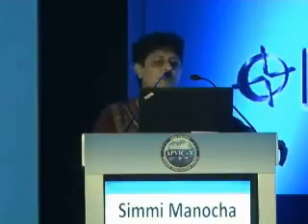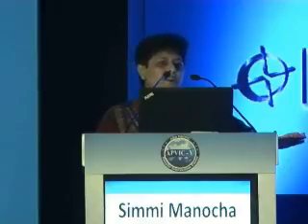So you can take a cut section, you can scan from the longitudinal view. The number one rule is that always begin with a good 2D image before turning on the color. That's the basic principle. And once you have a good 2D image, then you can put color and you'll get a lot of information. Thank you very much.